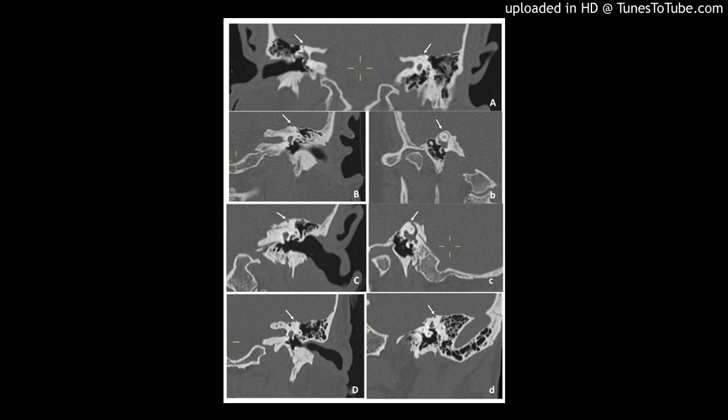The superior semicircular canal can now be exposed anteriorly and posteriorly, with dissection extending towards the middle fossa dura. As the middle fossa dura is approached, care should be taken to prevent injury and cerebrospinal fluid leak.